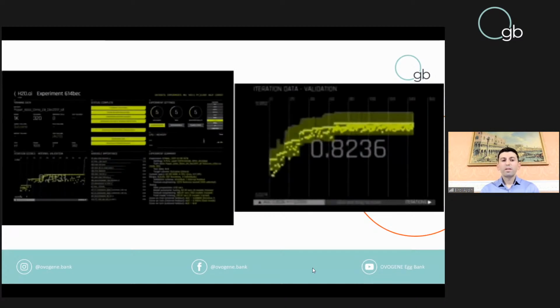So how will artificial intelligence give the final value, how will we know which oocyte is ready to freeze? As you know, when you make embryos, artificial intelligence gives you the percentage of implantation chance. It says, okay, this embryo has a 79% chance for implantation, or another embryo only 40%, another embryo 90%, so that you understand which embryo you will give priority for embryo transfer. So here we have something similar.